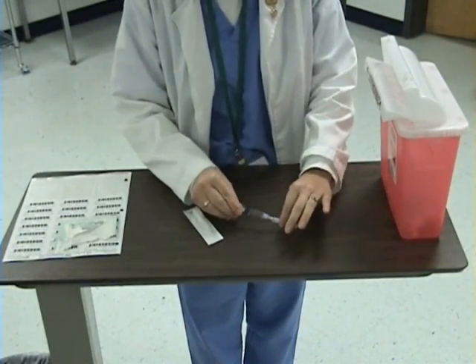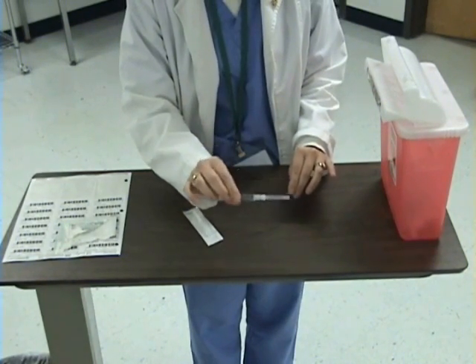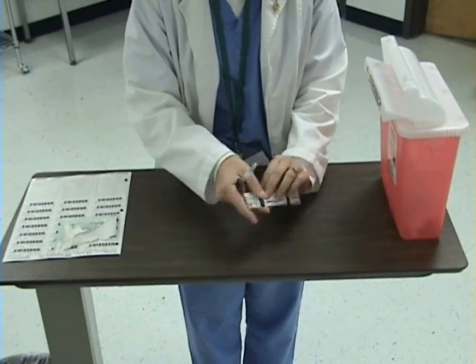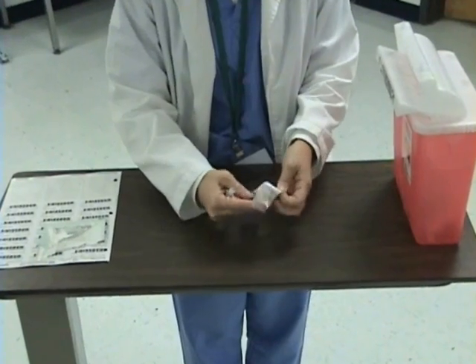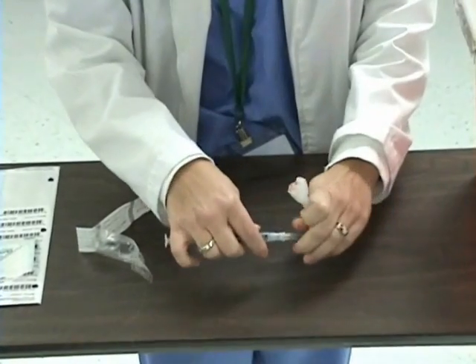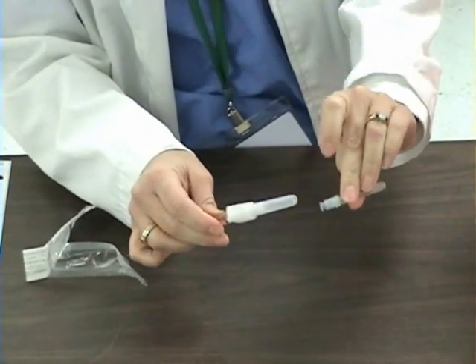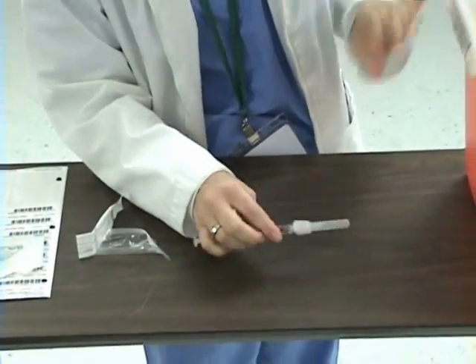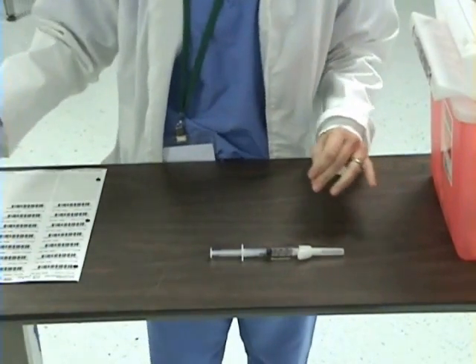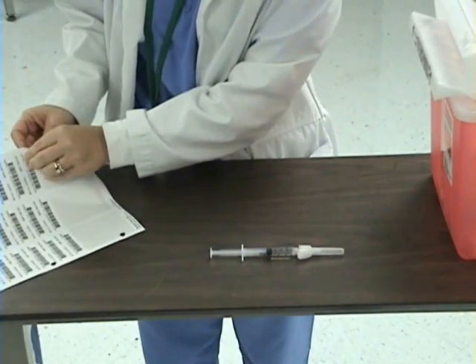I will recap my filtered needle passively. I am now going to change my needle so that I would be able to administer my medication to my patient. I will dispose of my filtered needle in my sharps container. At this point, I am going to label my syringe with a patient label, and it will include the medication, the route the medication will have, and the dose.